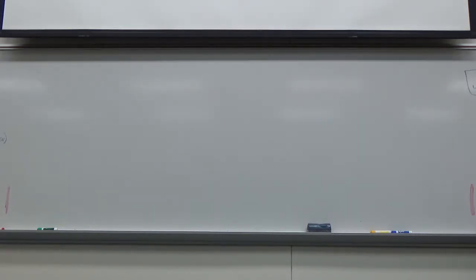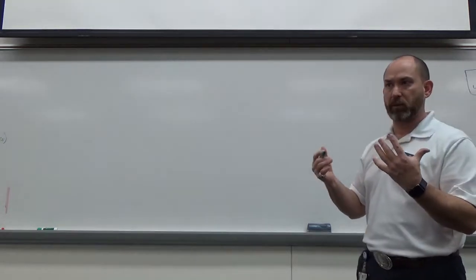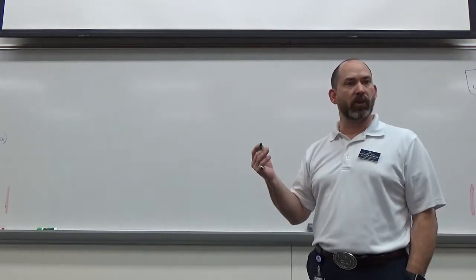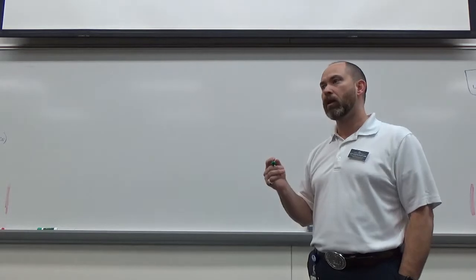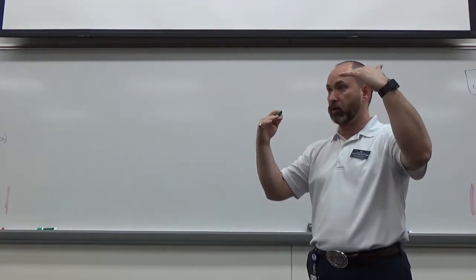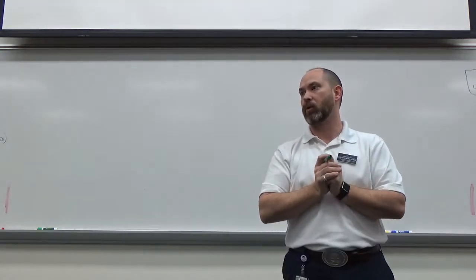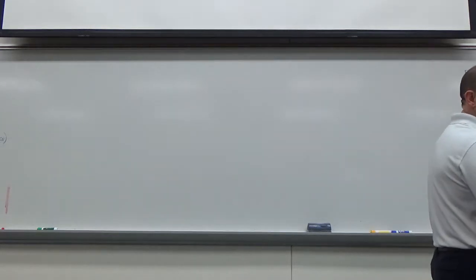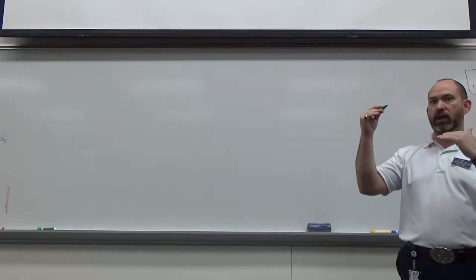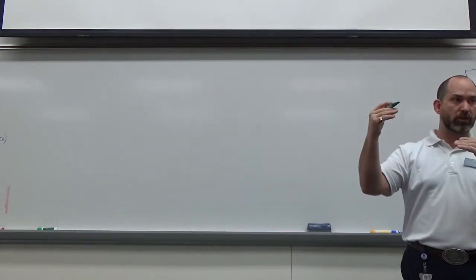What about Valsalva? What does Valsalva do in a normal situation? We're changing the pressures by having the patient bear down. They hold their breath and bear down real hard. What does that do to a normal waveform? It depresses the whole thing, but my E and A ratio stays the same. That's kind of our key, distinguishing what else is going on. We need to get a reversal. If it was looking normal and we cause that to change, we'll talk about that when we get into pseudo-normalization. It's going to switch the two.